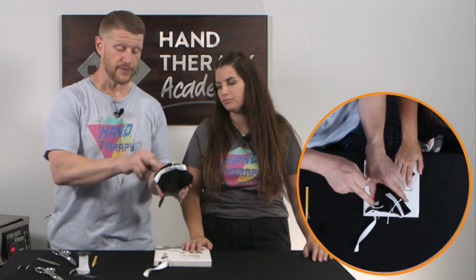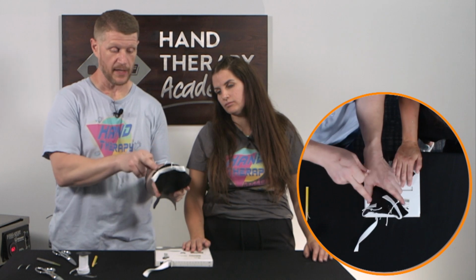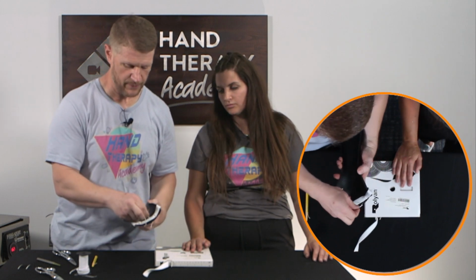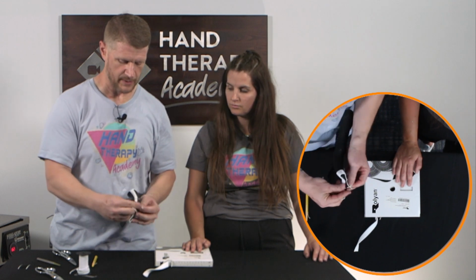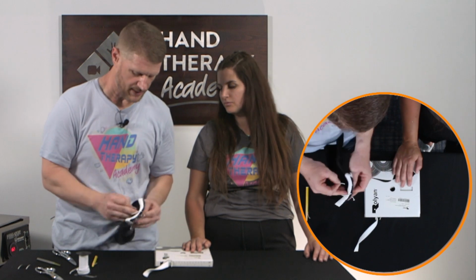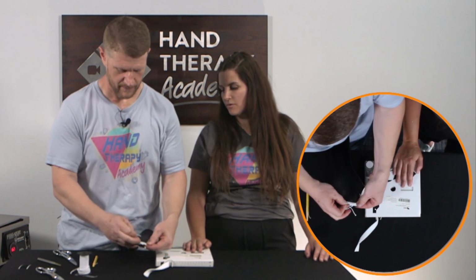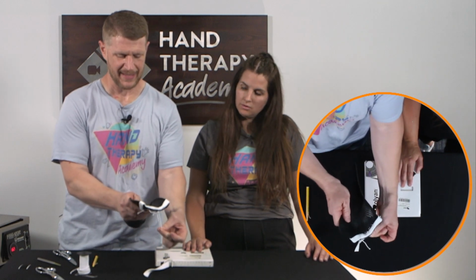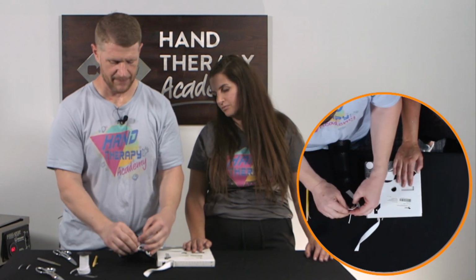Okay, so I've got 2 of them ready between index and long and between ring and small. Let's do between the index and long now. What I'm going to do is feed one through my pre-sized hole, and then I'll feed the other one through my pre-sized hole. Got to find it. Where'd it go? There it is. All right, so I take that and pull it through to the back side, and then I'm just going to tie 2 little slip knots.